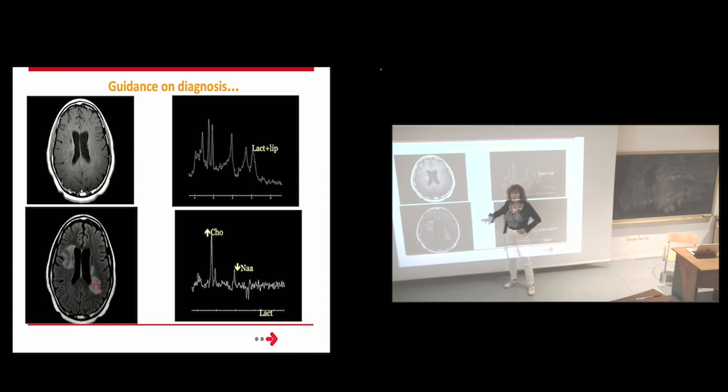When we want to make a map, we can have a less precise resolution to be faster for the acquisition. Because the problem is that the more precise you are, the longer the patient or the normal volunteer who does a simulation has to stay in the machine. And of course, you must not be claustrophobic. I don't know what the name is in English, because the more powerful the MRI is, the smaller the tunnel. So for me, it's okay to put my ankle, my knees, but to stay 2 hours in the machine with my brain fully in the tunnel, with a lot of noise, it's something very, very anxious.